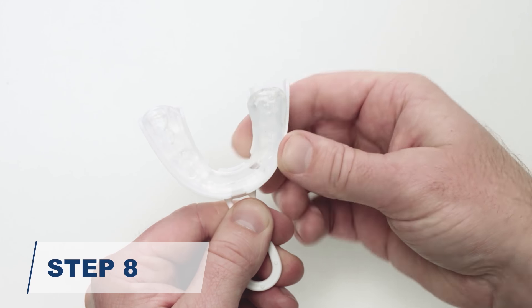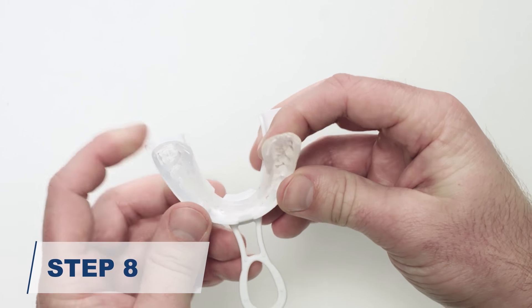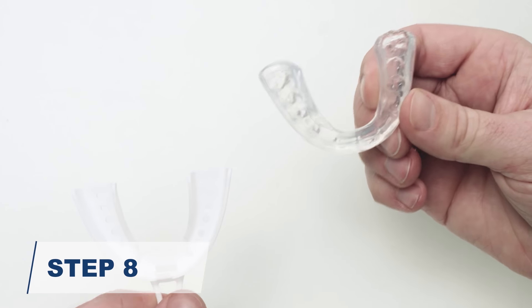Finally, remove the dental guard from the fitting tray. Start by gently pulling the ends from each side of the fitting tray, then work around to the front.